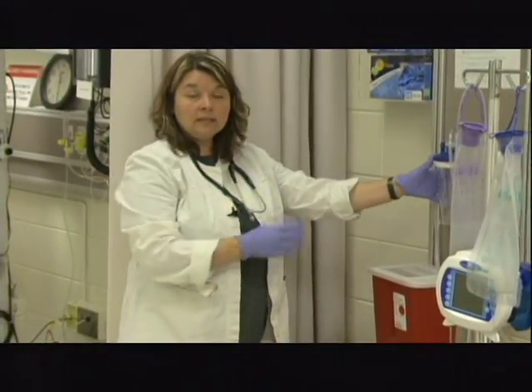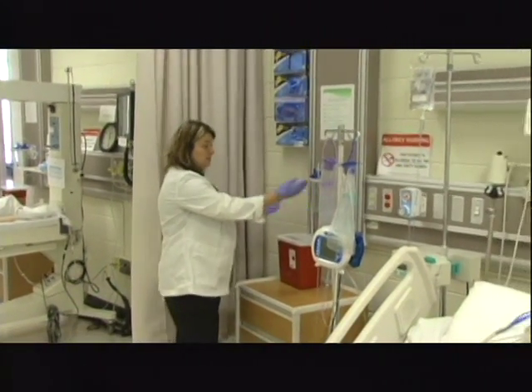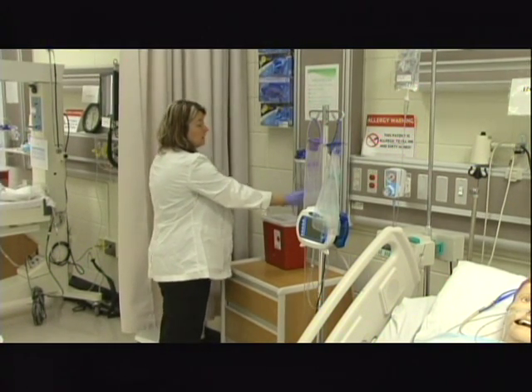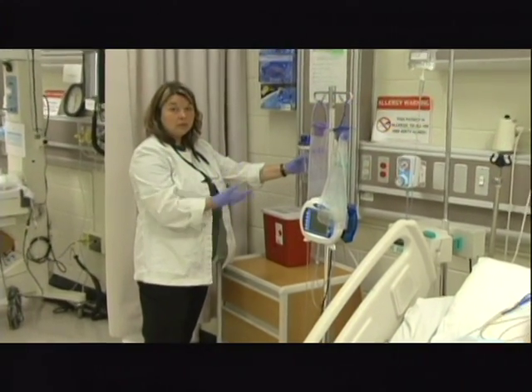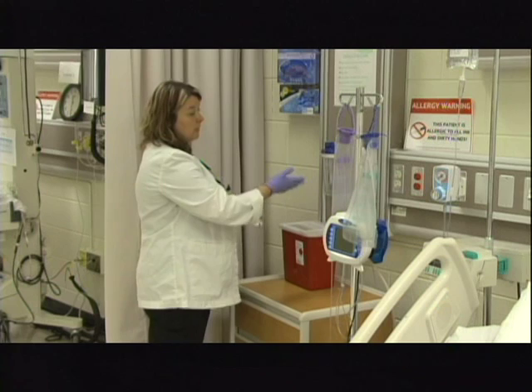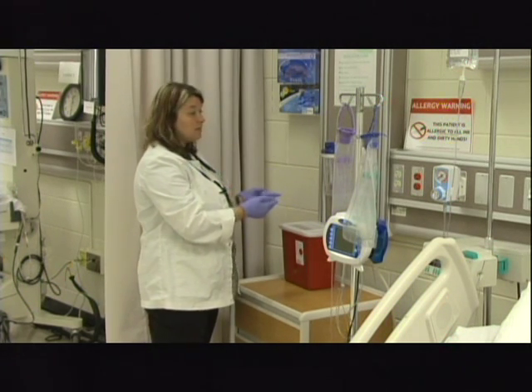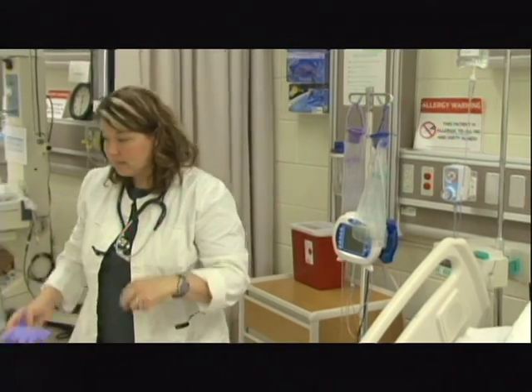Now, you are going to need to get rid of the suction canister based on agency policy. Some of them have an additive that they put in there to solidify the contents. But also, please remember, anything that is in the suction canister is considered output and therefore needs to be addressed as same. Anything that you put into the tube is considered intake and, again, needs to be addressed as the same. So when I got ready to dispose of this, I would most likely need a red bag and dispose of it per agency policy. I'm not going to do that at this point. Instead, I'm going to come over and I'm going to take my gloves back off and I'm going to go ahead and foam again.